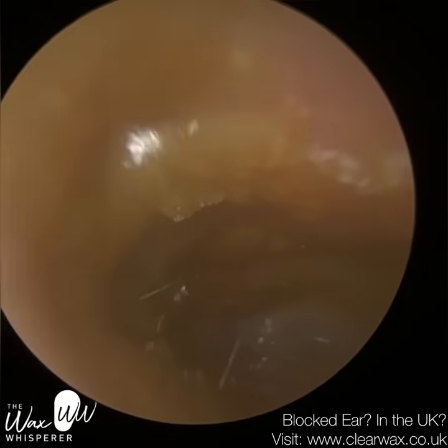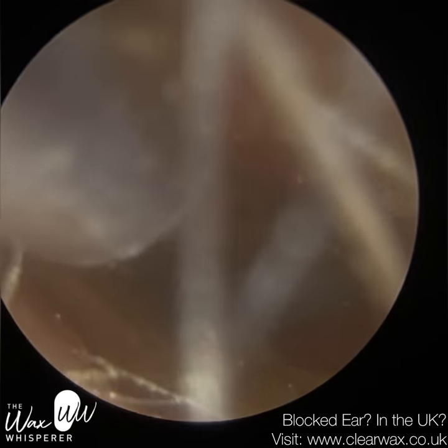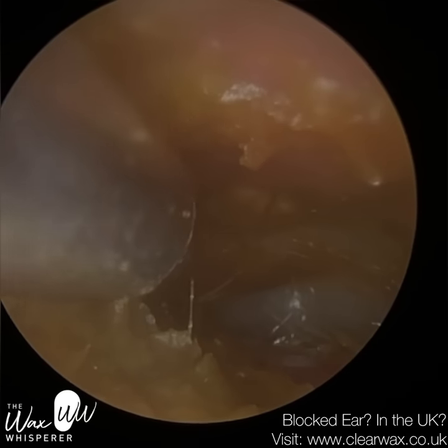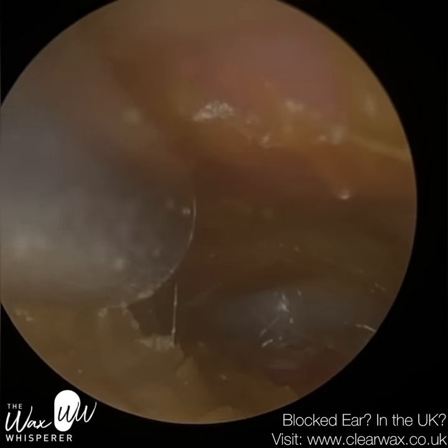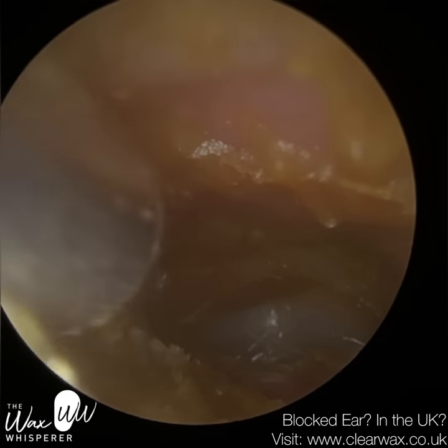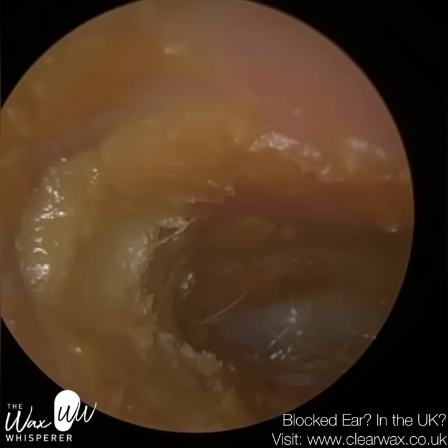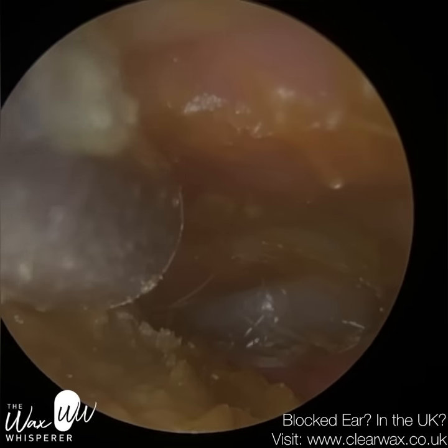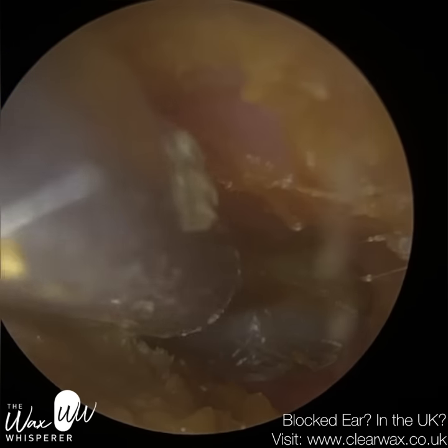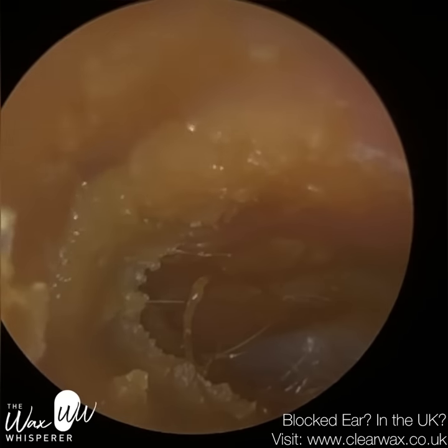So it's a small area that we're working in, which makes it a bit more tricky. You can see we've got some soft debris at the top. Throughout the procedure I'm just checking the patient's okay — just gliding and hovering over. Any other consistency of wax or dead skin would come away, getting attracted by the suction and peeling away in larger pieces. But here I'm almost inadvertently spreading some of this as well — so although I am vacuuming and getting some of it out, other parts I suspect are just being pushed and compressed against the canal, which is counterintuitive. So it's that fine line of knowing when to stop.